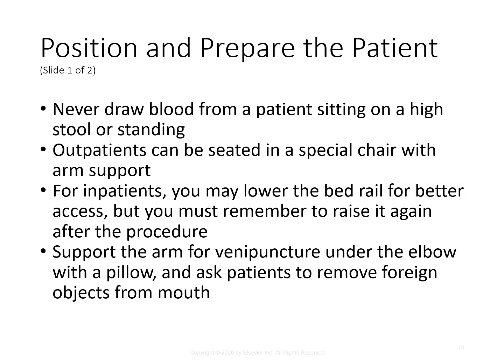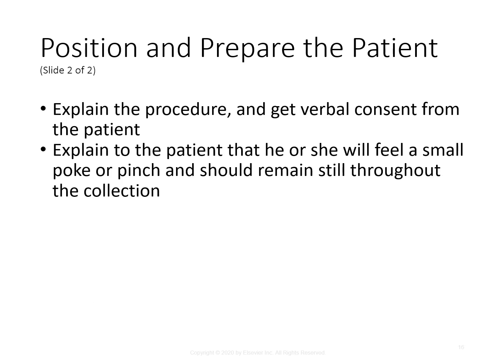choking hazard. Once we get them positioned and prepared, we're going to explain the procedure and make sure we get that verbal consent from the patient, where you're going to explain to the patient that he or she will feel a small poke or pinch and should remain still throughout the collection process.